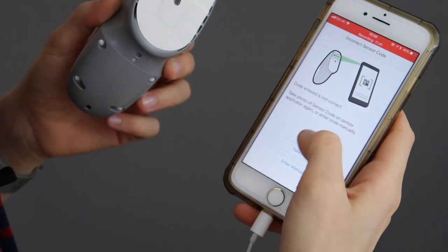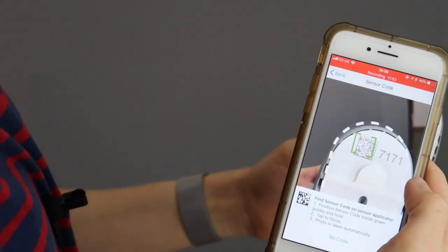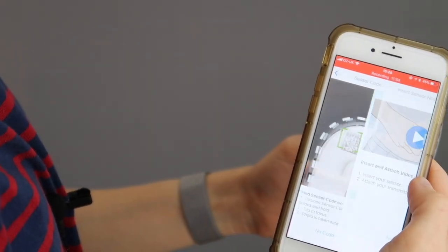Let's get this baby out — that just feels futuristic, I don't know, it just does. Scanning it, which is very clever — I just scan the code on the sensor applicator. So that's my sensor paired.